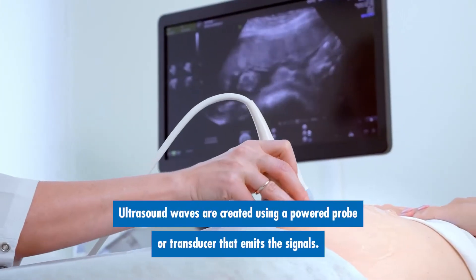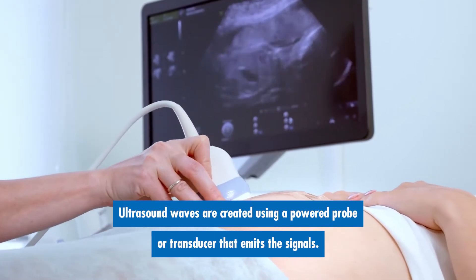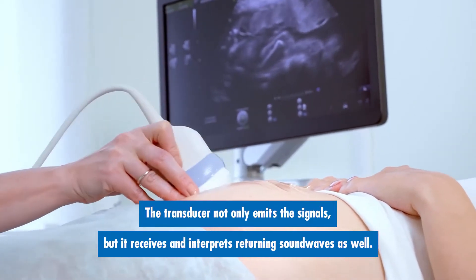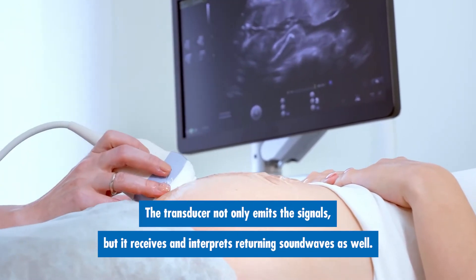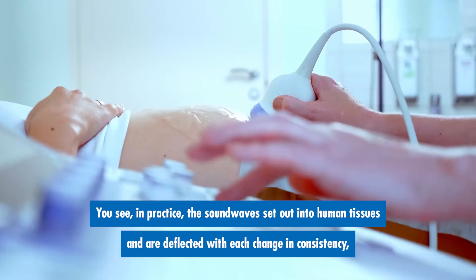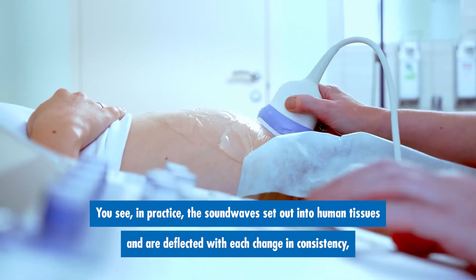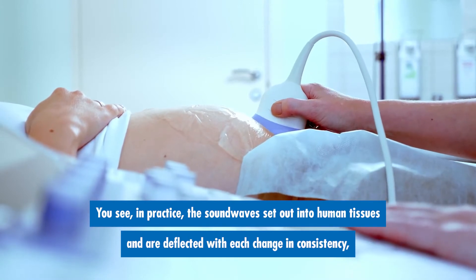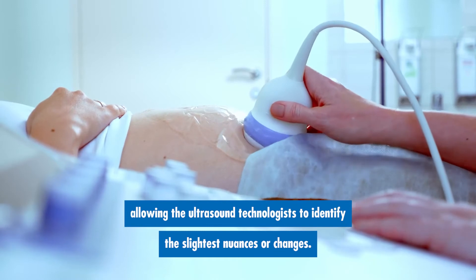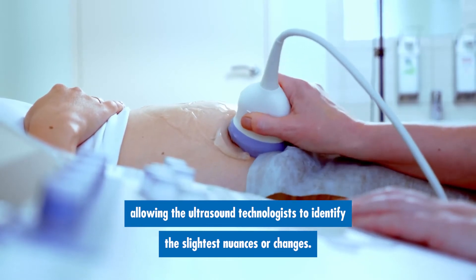Ultrasound waves are created using a powered probe or transducer that emits signals. The transducer not only emits the signals, but it receives and interprets returning sound waves as well. In practice, the sound waves set out into human tissues and are deflected with each change in consistency, allowing the ultrasound technologists to identify the slightest nuances or changes.